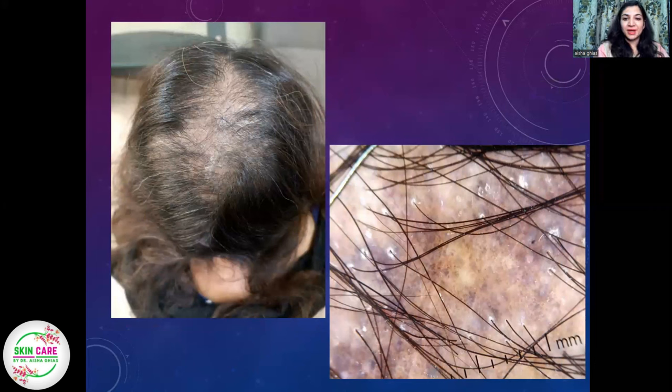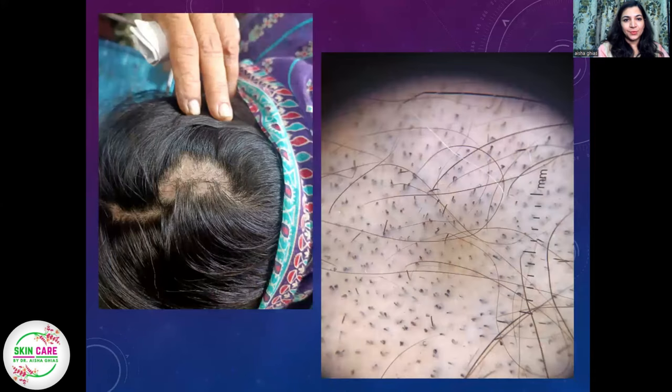All right, case number five. Also, loss of hair from the middle of the scalp, and on trichoscopy, lots and lots of globules and dots. Dots and globules of pigmentation on the scalp with empty hair follicles, no follicles. Some of the hair follicles are having scaling in them. And then focus on this, the hair density is pretty much reduced. Also seems like an inflammatory disorder. Okay, another case, I would label it as case number six.